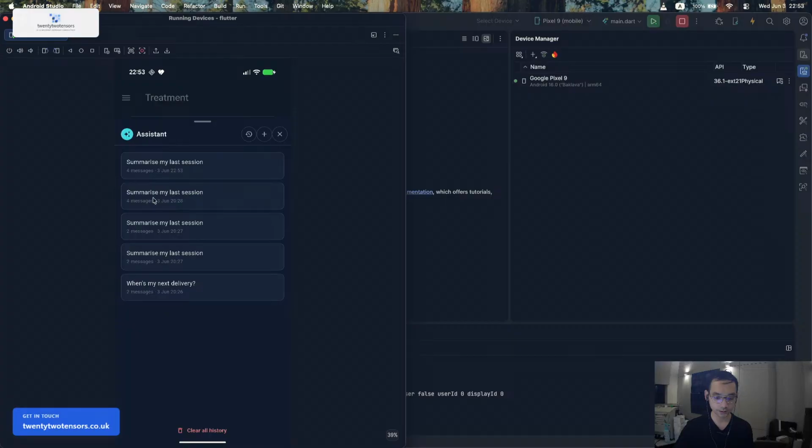And the next task is the inventory task. For home dialysis patients, we need to manage the inventory.